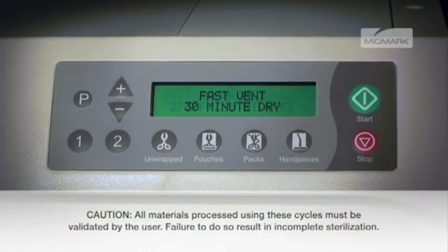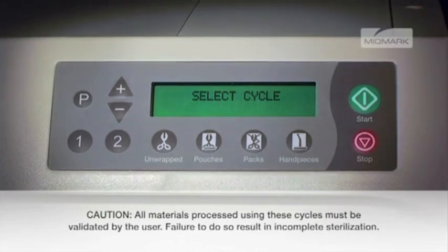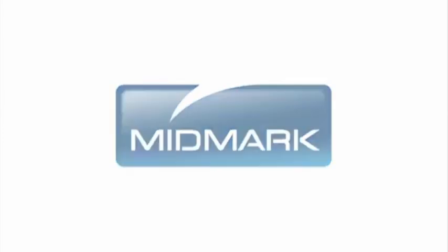Pressing the stop button any time during the programming procedure will cancel the changes and revert to the original settings. For more detailed information about maintaining your autoclave, please refer to the M9-M11 Installation and Operation Manual.